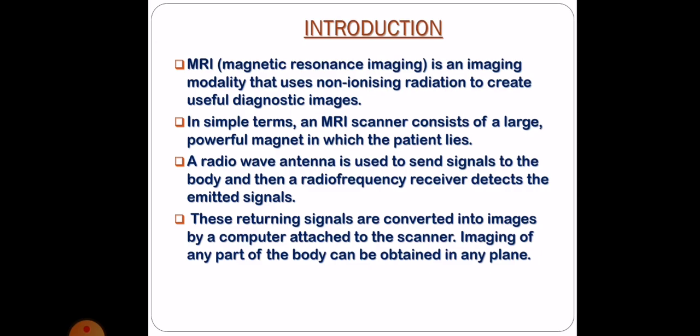It has the ability to obtain direct transverse, sagittal, coronal and oblique images regardless of the plane, and all the MR images are presented as thin slices similar to those of CT, but without any superimposition of overlying and underlying tissues. That means there are no pathology misses.